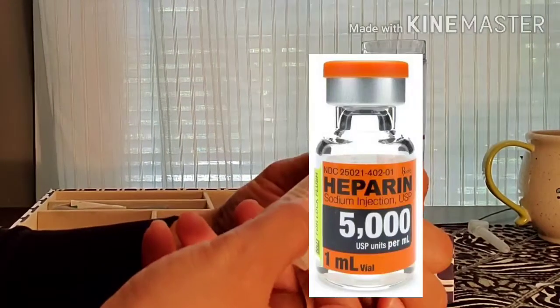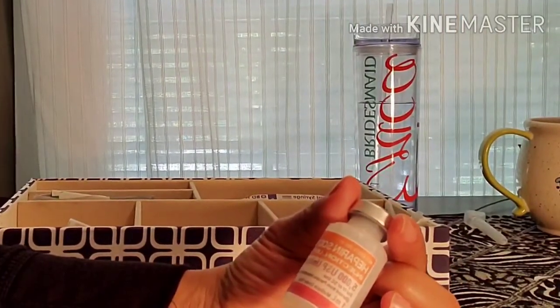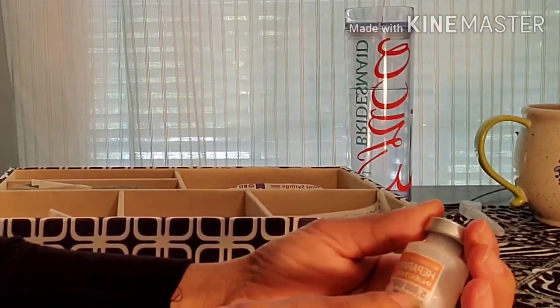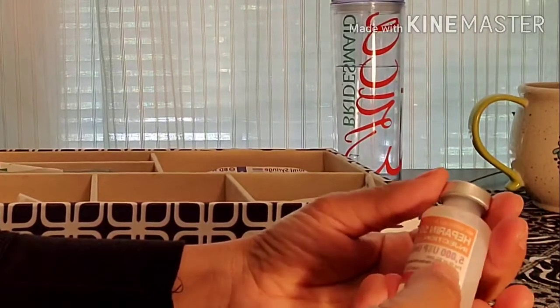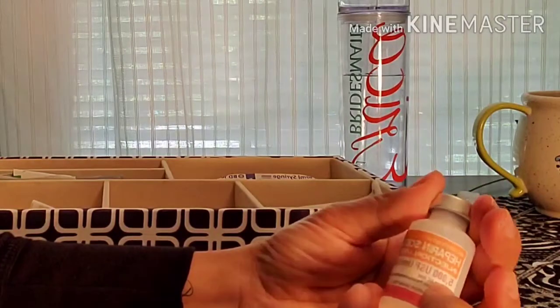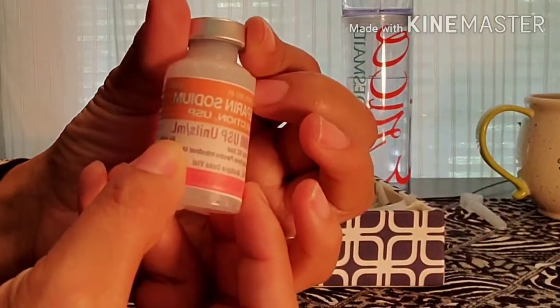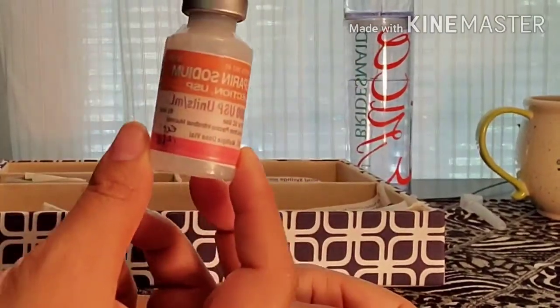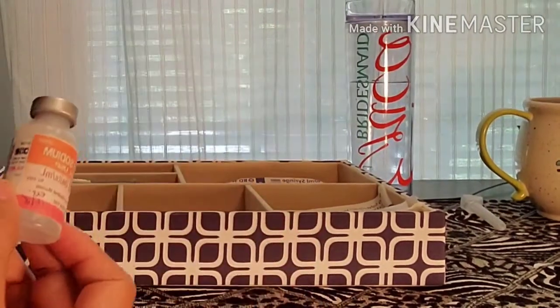My doctor ordered 5,000 units sub-q BID, so that means I'm going to be administering one milliliter. With insulin we use an insulin syringe measured in units, but with heparin we don't go by units — that insulin syringe is only 100 units, so 5,000 units would be impossible on one syringe. Here we work in milliliters, so 5,000 units equals one milliliter, meaning 2,500 units would be half a milliliter.